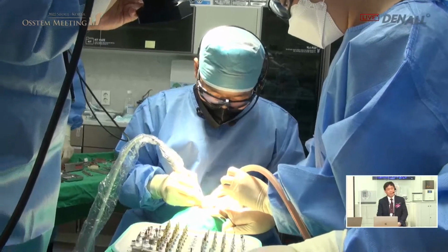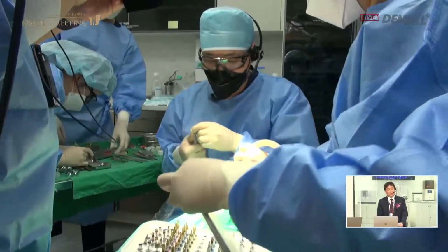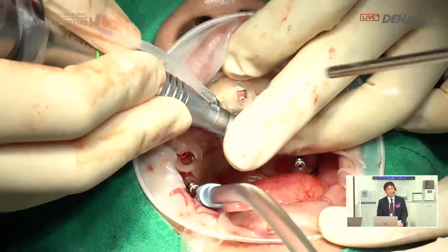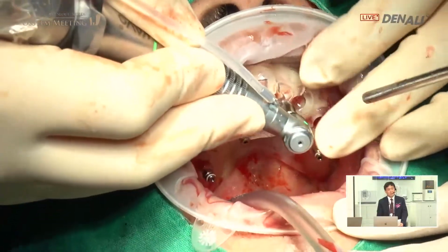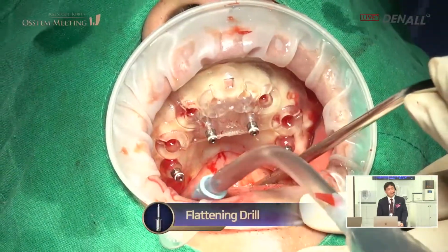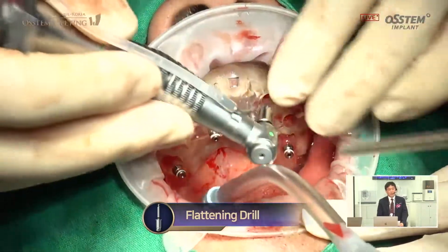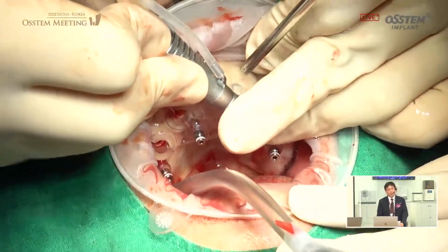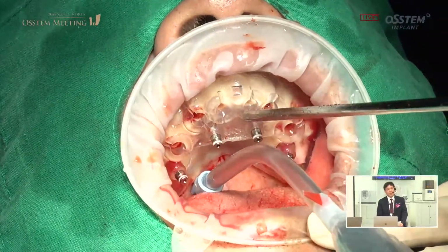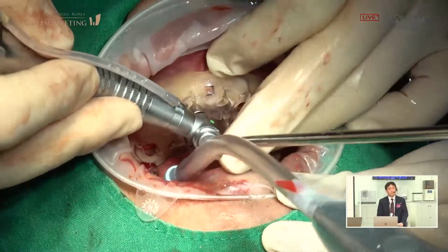the patient's old denture is going to be used on the maxilla and in the mandible. Immediate loading will be applied. So that's how we determine the mode of temporaries. So there are some unexpected situations. So we have two options.